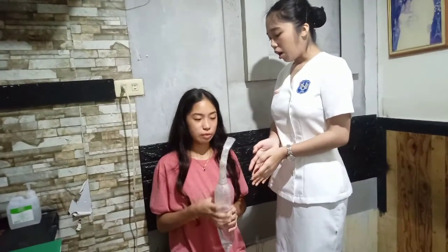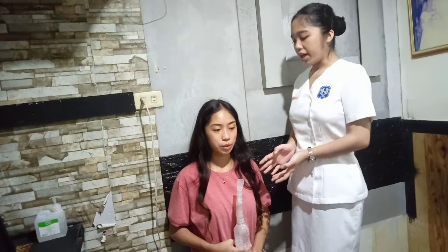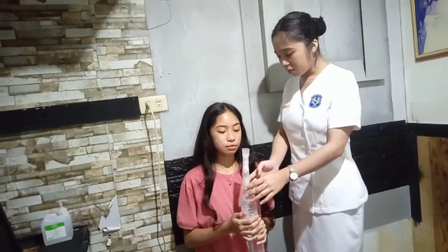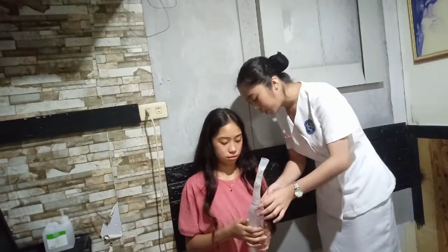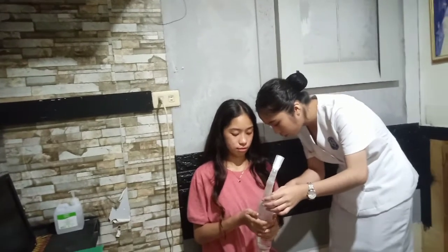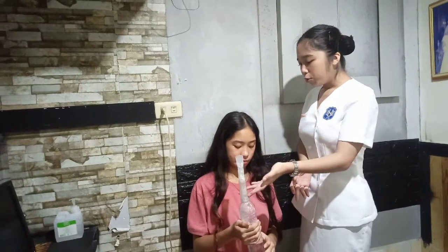Now you have to exhale. Okay, you have to breathe in through this device to reach our goal, which is the recorded goal for today, 2,000. You have to breathe in like it is a straw.